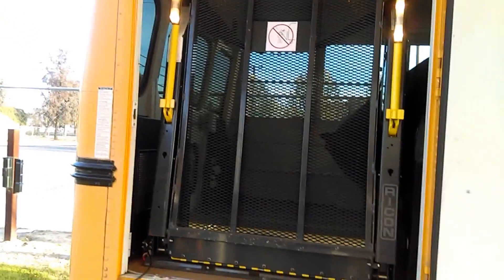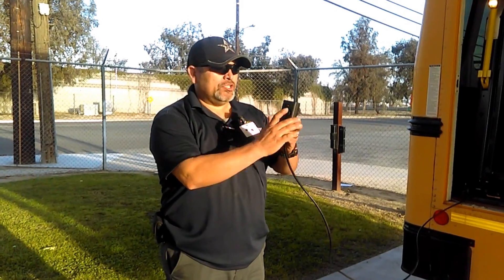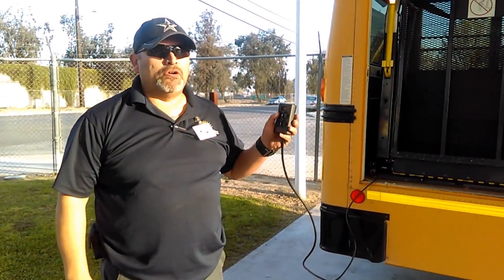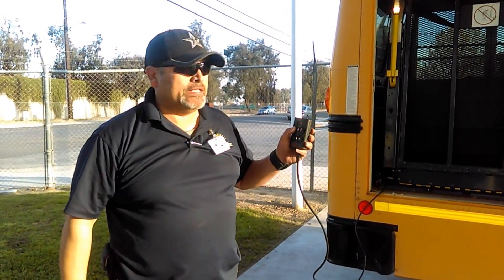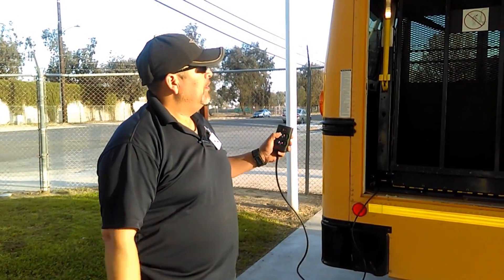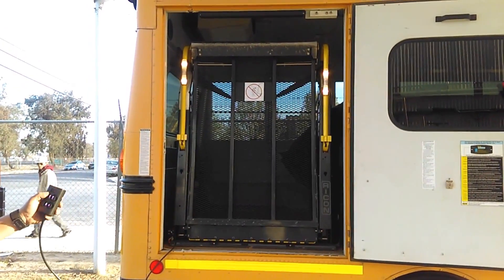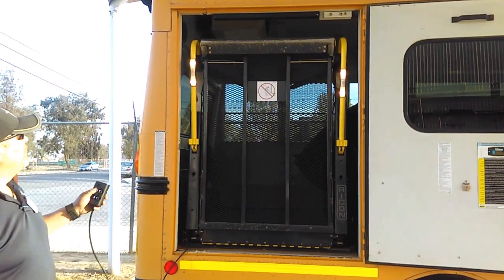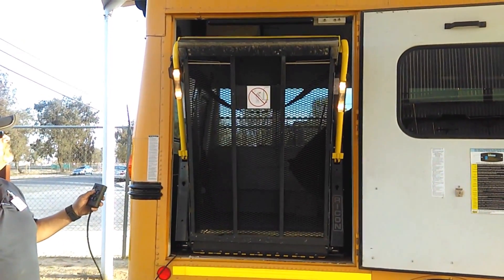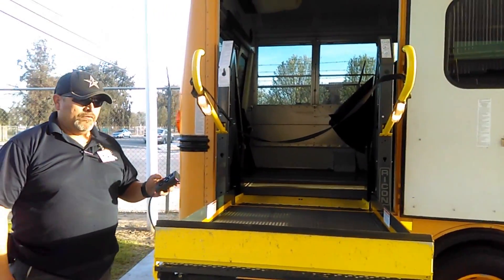Whenever you operate a wheelchair lift, you want to be away from the bus. You turn on the power switch and deploy the wheelchair lift. What I'm looking for is no jerking or pulling. Now I'm going to put the wheelchair lift all the way down.